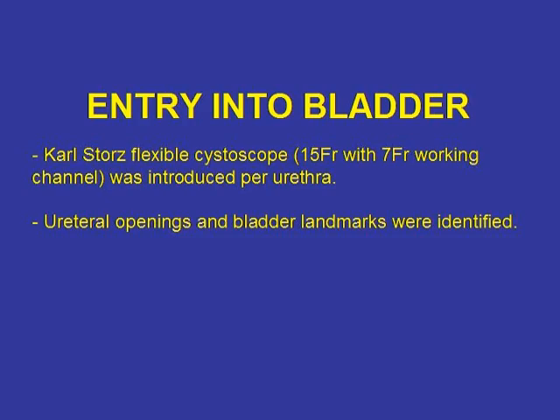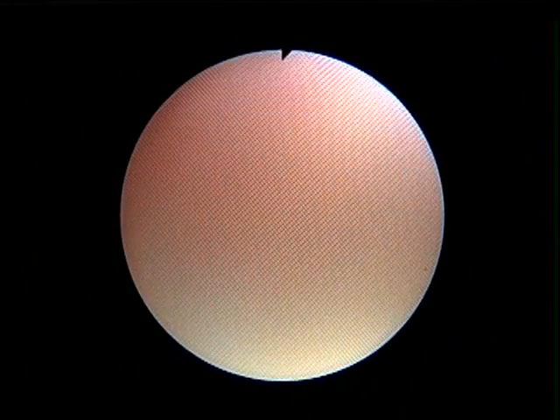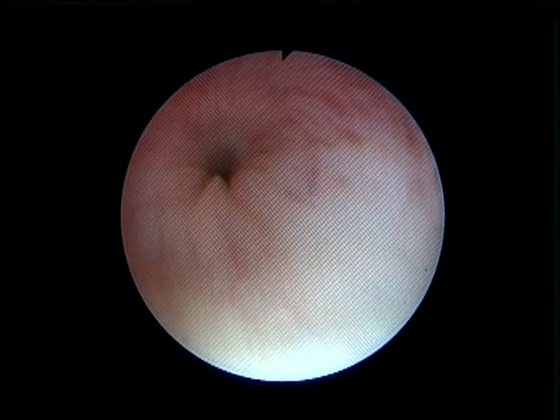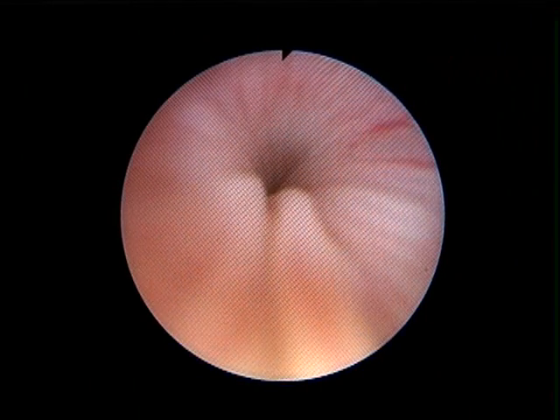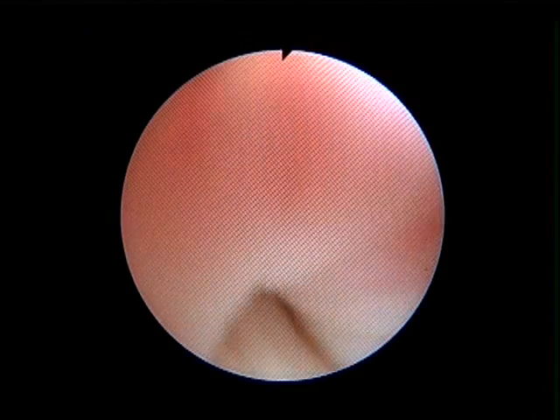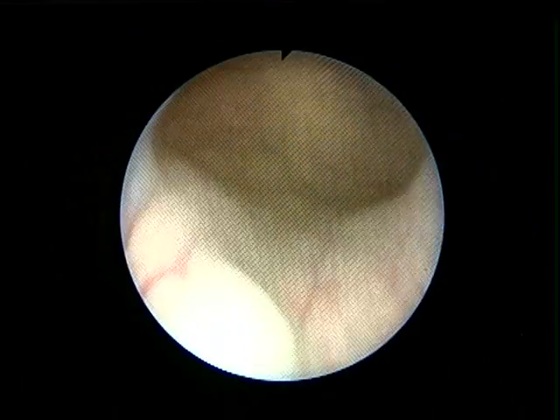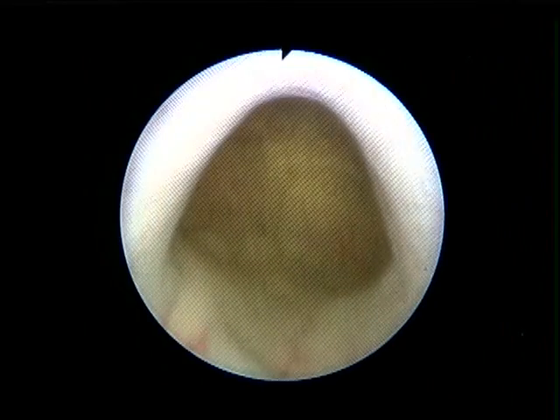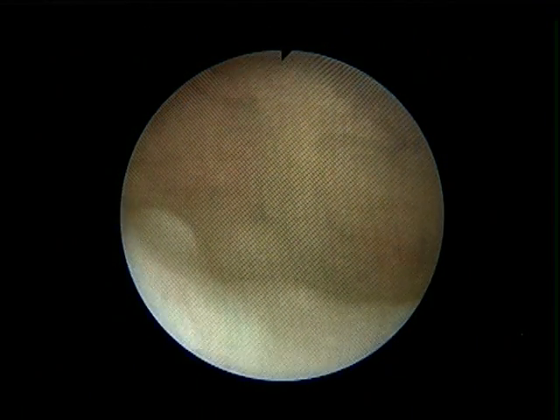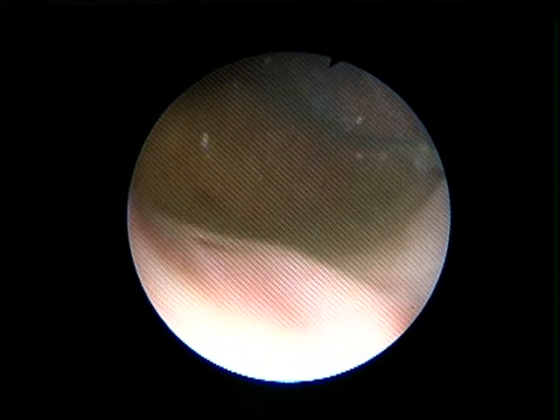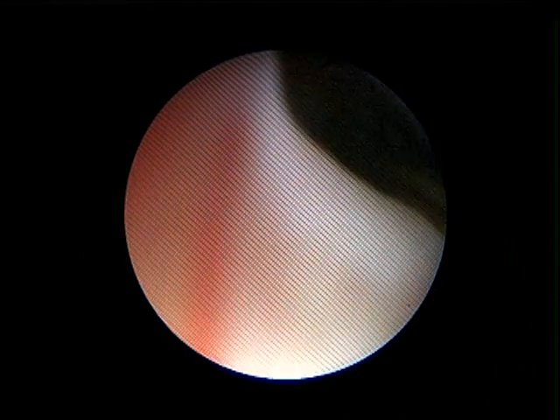Cystoscopy was done and the bladder landmarks were identified. The video shows the urethral sphincter and the entry into the bladder. Bilateral ureteric orifices were identified and a safety guide wire was placed.